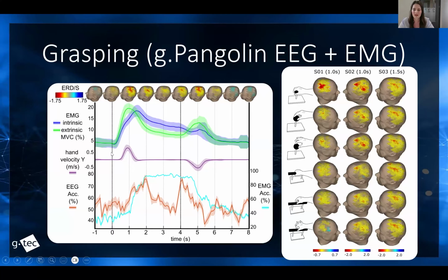So one row below, we have some information from the motion camera. There's a lot of information you can extract, but this particular channel gives us information about the vertical movement of the hand. So here you see, again, a bit of reaction time, but here the hand is lifted towards the object, and here at the end of the trial, it's removed from the object back to the table. And these patterns also help us explain how our accuracy behaves over time.